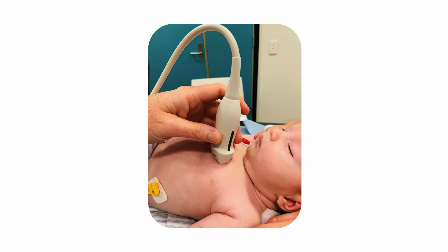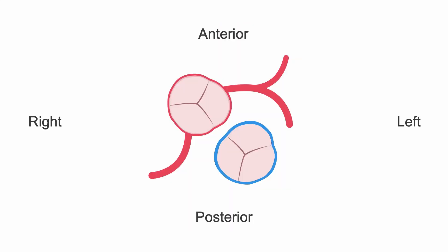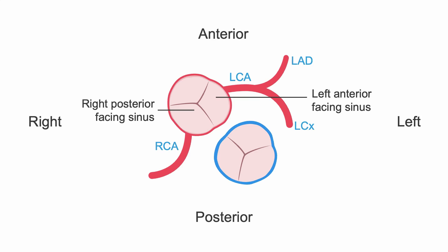The parasternal short axis view with a slight clockwise rotation of the probe allows for the coronary arteries to be visualized. In this view, it's possible to see the orientation of the left and right coronary arteries. The usual arrangement in TGA is the left coronary artery (LCA) arises from the left anterior facing coronary sinus and bifurcates to the left anterior descending artery (LAD) and the left circumflex artery (LCX). The right coronary artery (RCA) arises from the right posterior facing coronary sinus and continues to the right.